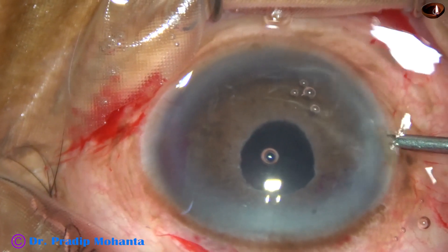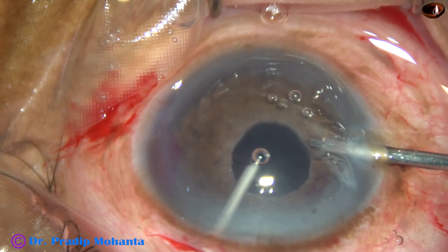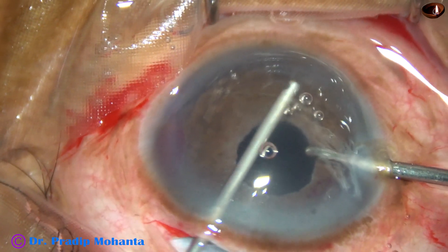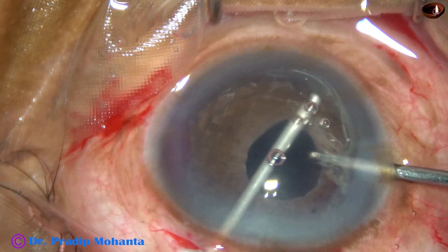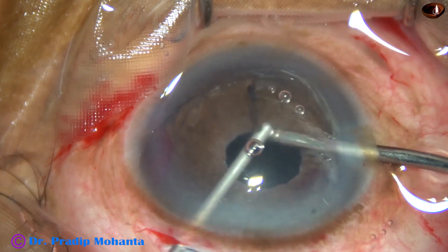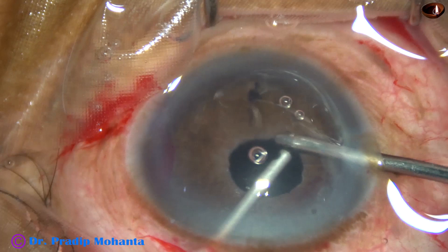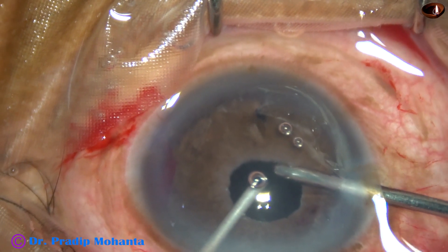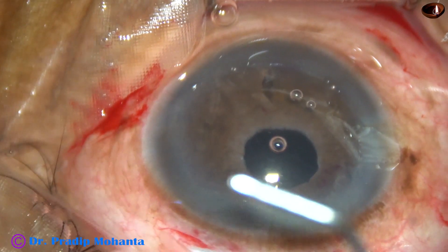And now my plan is to do a peripheral iridectomy at 6 o'clock. I find that the iris tissue is stuck, so I had to be careful. I did not remove a lot of iris tissue. There is some hyphema at 3 o'clock that was removed.